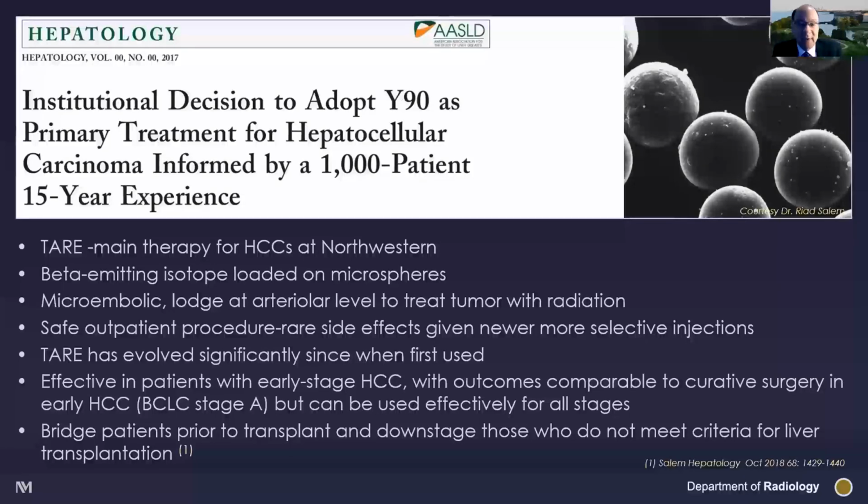What's nice about it is it's an outpatient procedure. There are rare side effects given the selective injections. The patients can go home after the procedure, and it has evolved significantly since it was first used. It's basically effective in all stages of HCC, especially the early stage, with outcomes comparable to curative surgery in early HCC, but we can use it in all the different stages. What's interesting too is that there are a number of patients that we've done who were not transplant candidates, or you were able to bridge the patients so that they didn't have advanced disease at the time of transplant. And some of these patients who didn't meet the criteria for transplant were able to get transplanted.